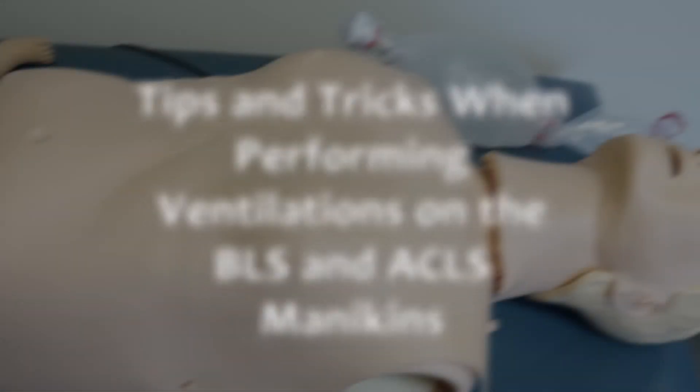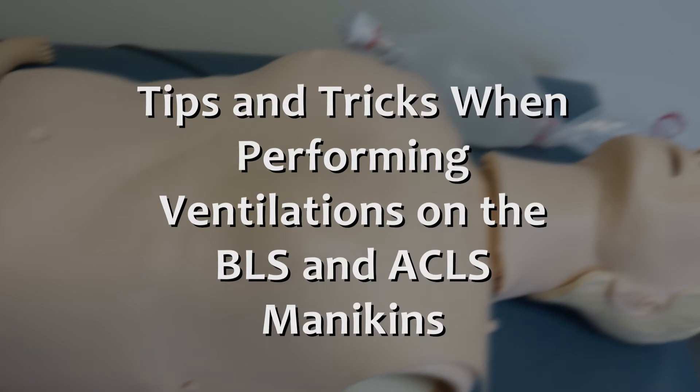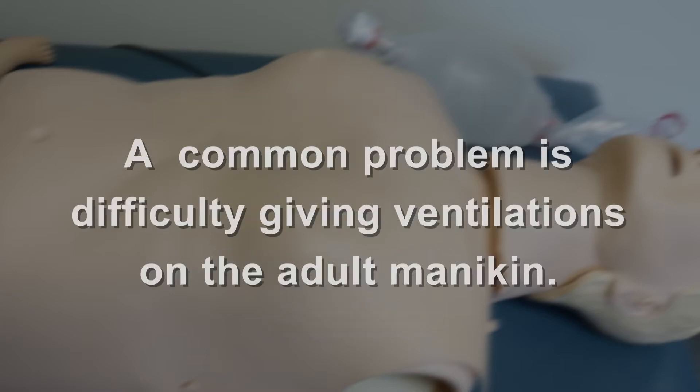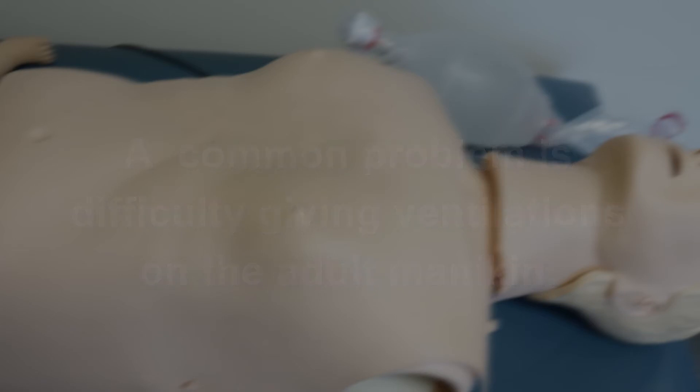For today's Wiser Minute, I am going to give you some tips and tricks when performing ventilations on the mannequins we use for our BLS and ACLS programs. A common step that people have trouble with is giving successful ventilations on the adult mannequin.